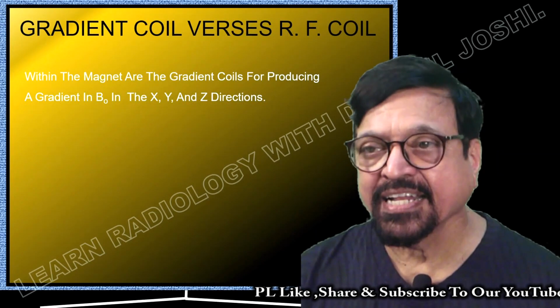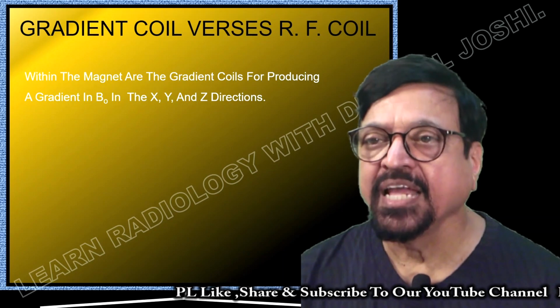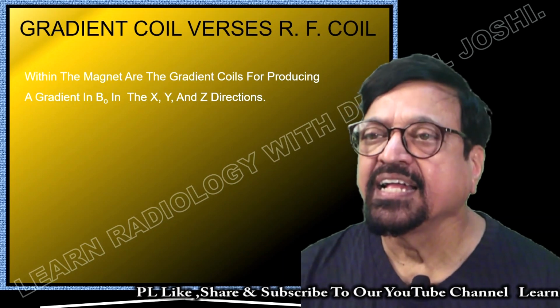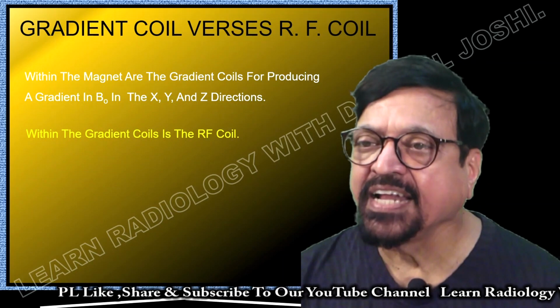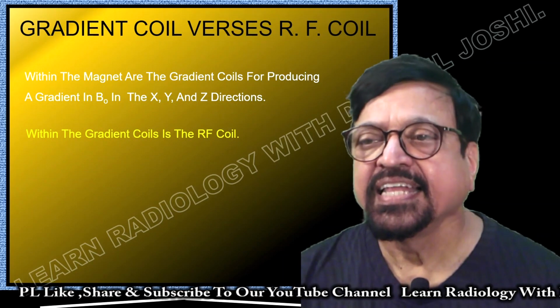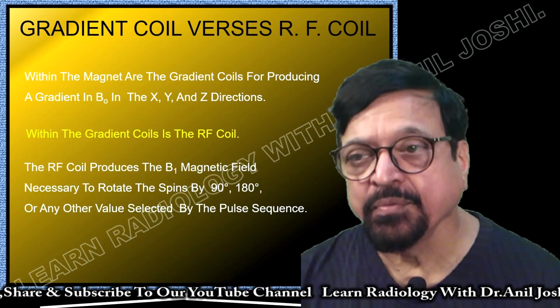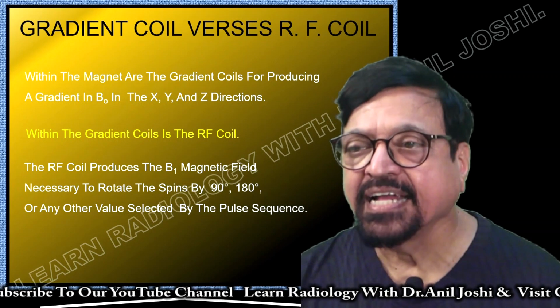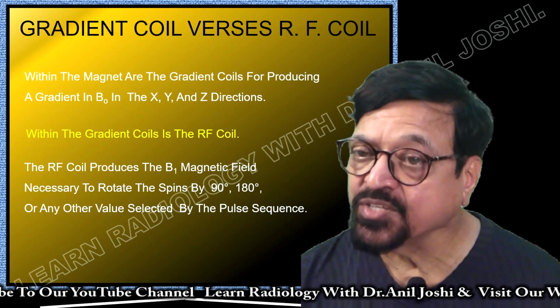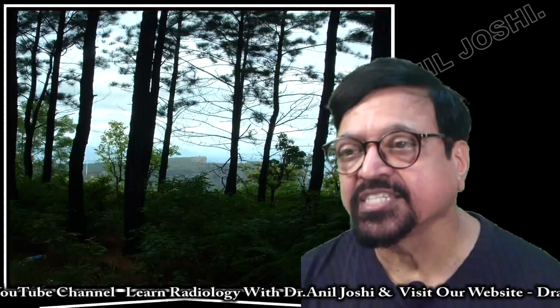Now within the magnet, the gradient coils produce a gradient in the B0 field along the X, Y and Z directions. What is done within the gradient coil? There is an RF coil. Now the RF coil produces the B1 magnetic field necessary to rotate the spins by 90 degrees, 180 degrees or any other value selected by the pulse sequence.